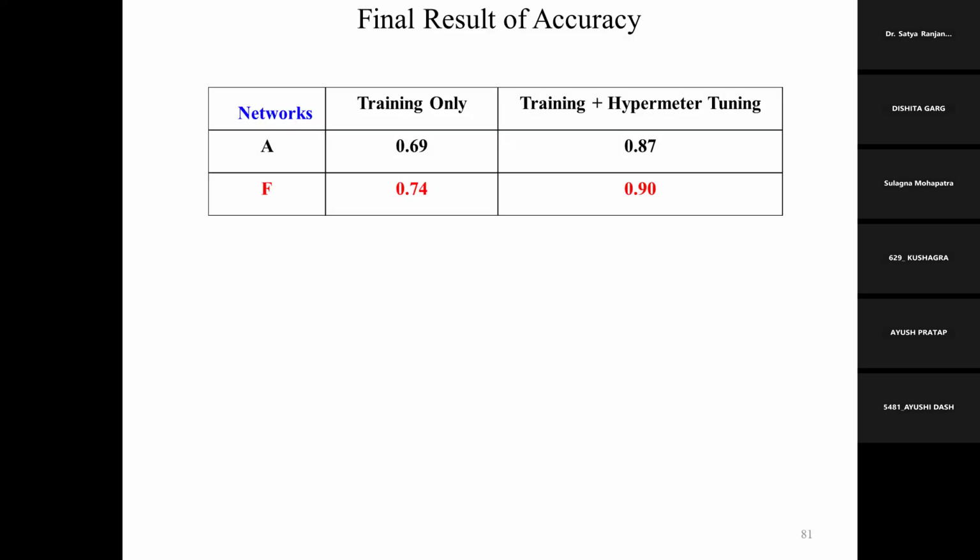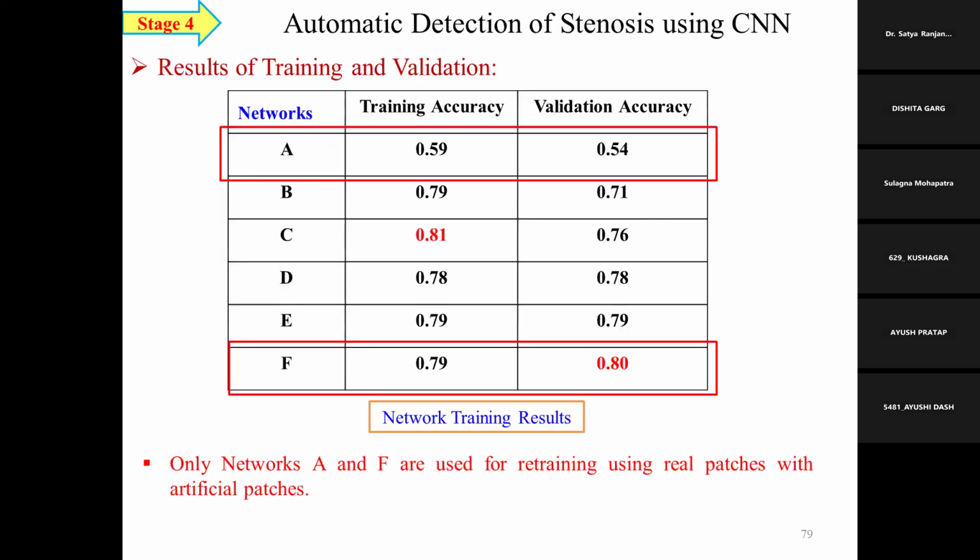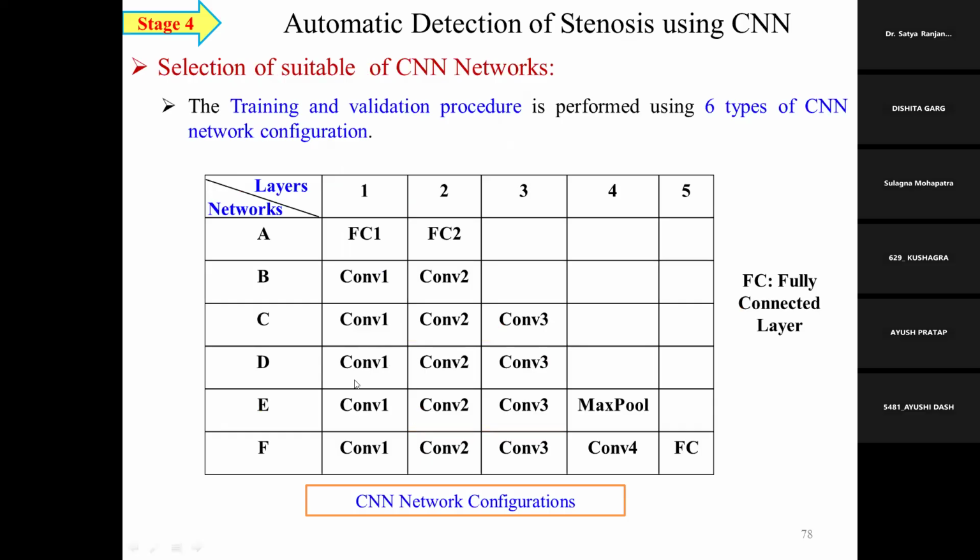With fewer layers we sometimes get better accuracy, and with a higher number of layers we can also get better accuracy. So we can only go through combinations of layers, through a hit and trial method. My intention is to show many combinations. Even with fewer layers, even with higher layers, they are getting some accuracies. Then how do we know which one gives us the better result? So it's an experimental way to find out the suitable CNN model for our data.